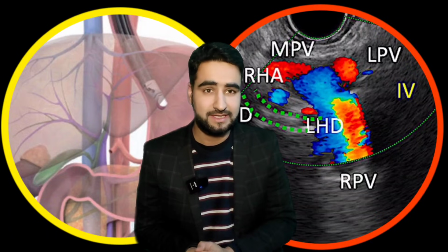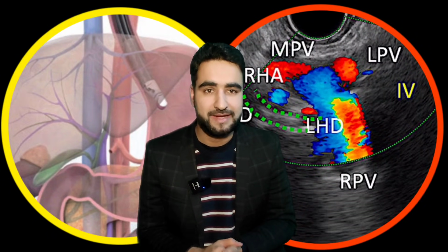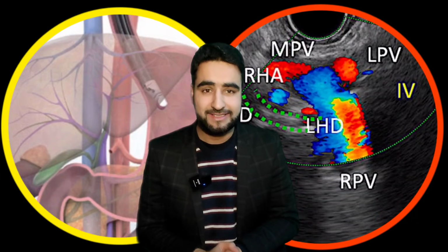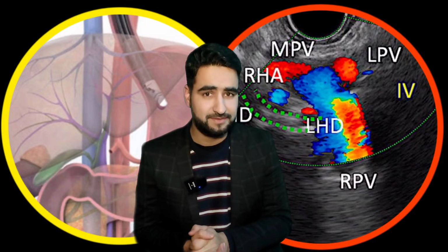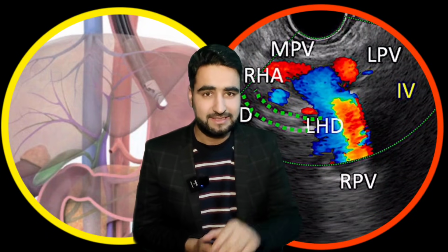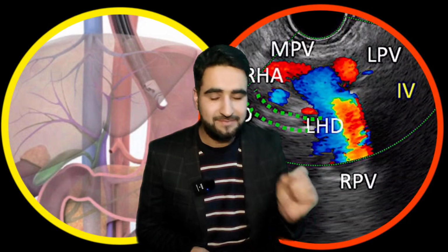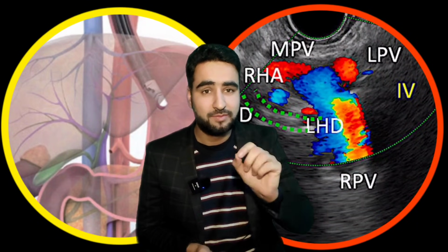Alongside the portal vein, a globular anechoic structure, this is your common hepatic artery. Running parallel to the main portal vein, a tubular anechoic structure, this is your common hepatic duct. Here is an important spatial relationship to remember. Between the main portal vein and common hepatic duct, the main portal vein is closer to your probe when examining from the GE junction station. Why? Because it is positioned more medially compared to the common hepatic duct.